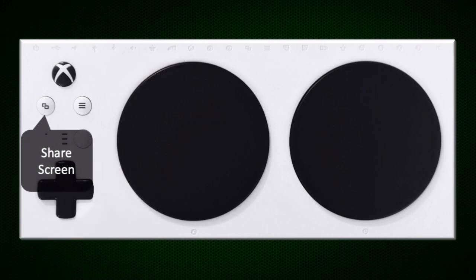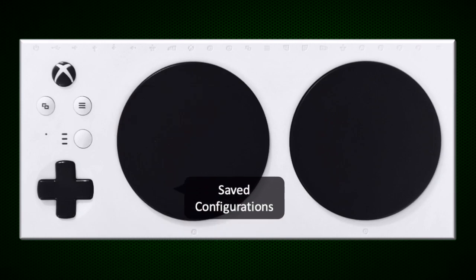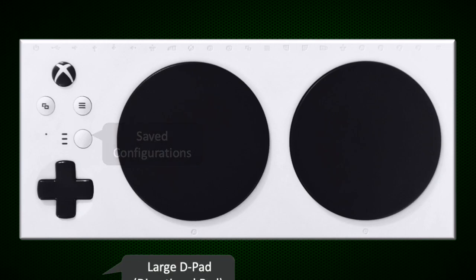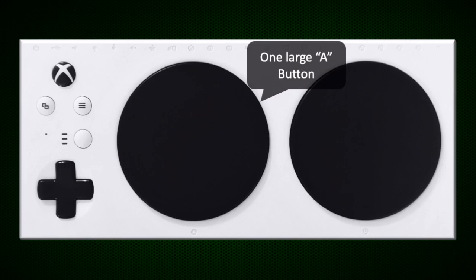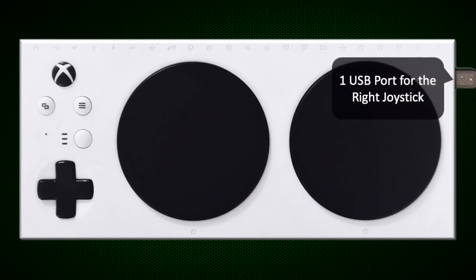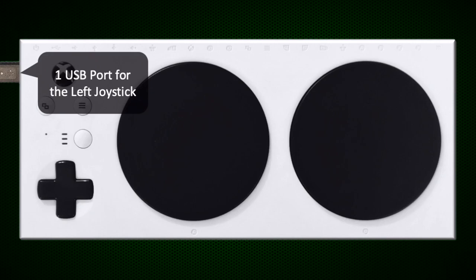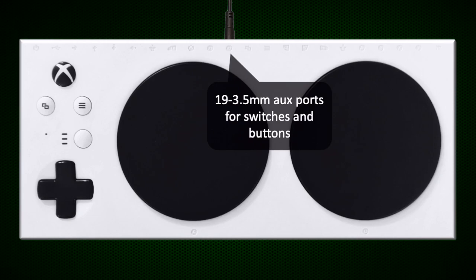The Xbox Adaptive Controller is a great addition to the Xbox One. It offers gamers everywhere an opportunity for individualized gameplay. It offers an Xbox button, a share screen button, a menu or options button, saved configurations, a large D pad — also known as a directional pad — one large A button, one large B button, one USB port for the right joystick, one USB port for the left joystick, and 19 3.5mm aux ports for switches and buttons.